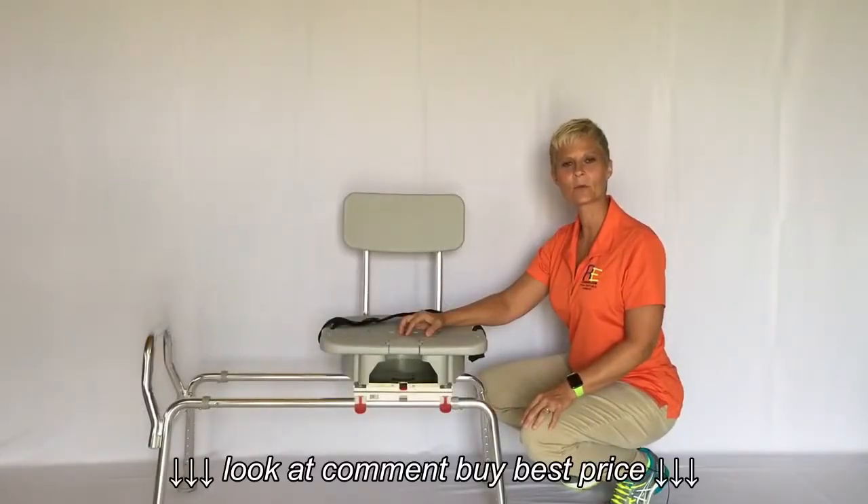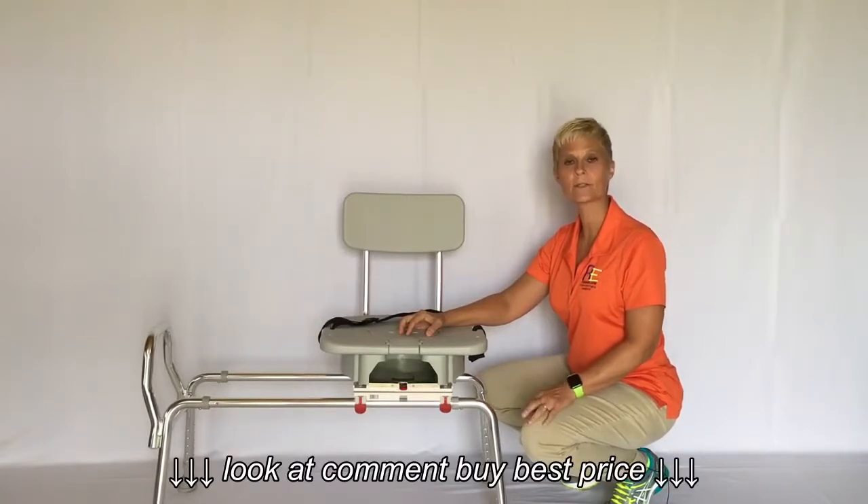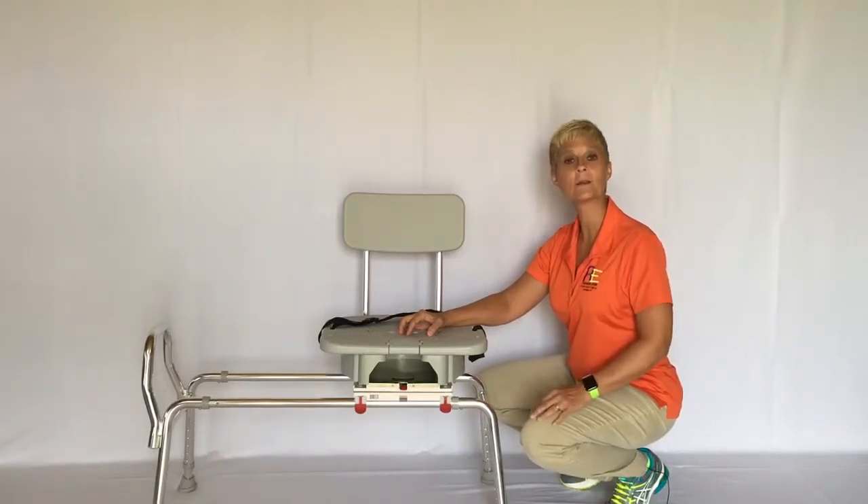Cindy here, physical therapist with Adaptive Equipment Corner. Today we're going to do a review on a swivel sliding transfer bench. This product was sent to us by Eagle Health.